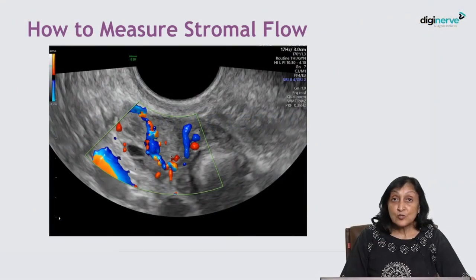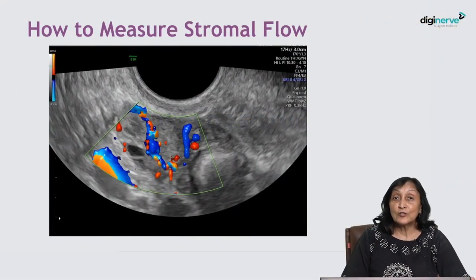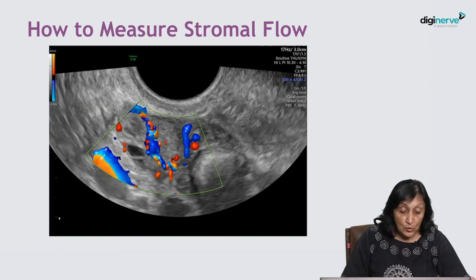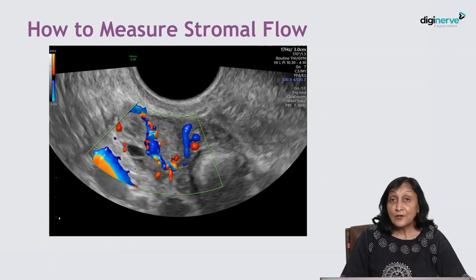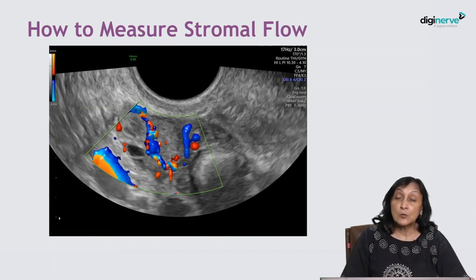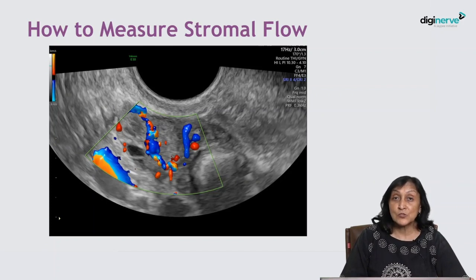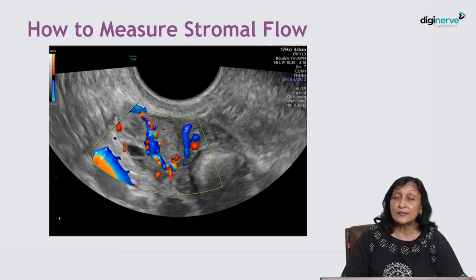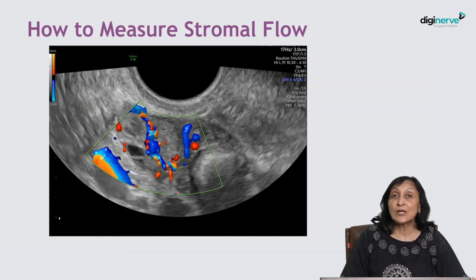Ensuring the ovarian stromal flow is a bit of a learning curve, because you have to measure the flow in the vessel which is the brightest, which is in the middle of the stroma, which is not close to the follicle and is also away from the hilar plane.